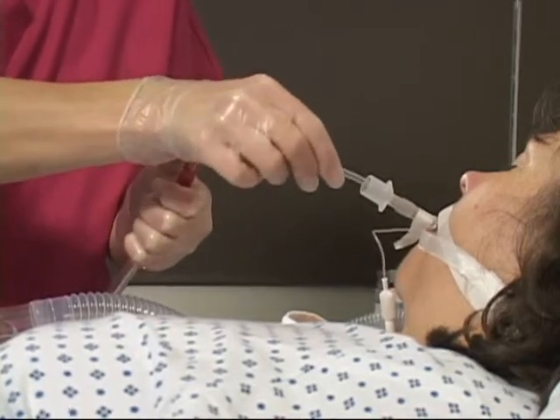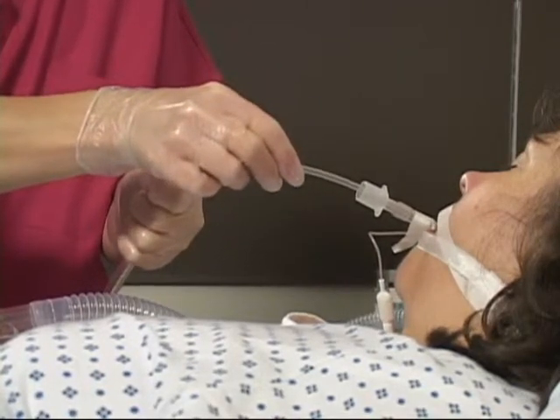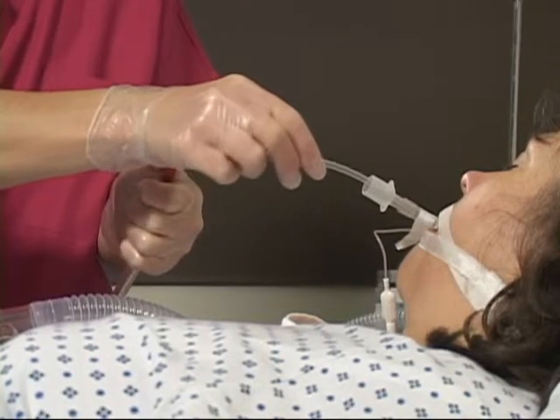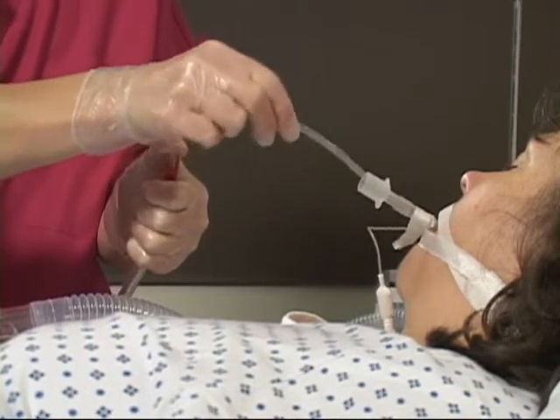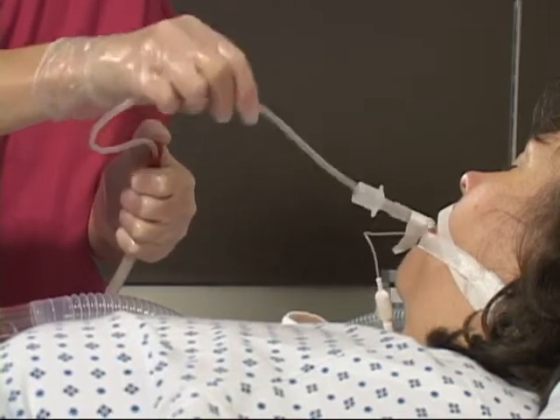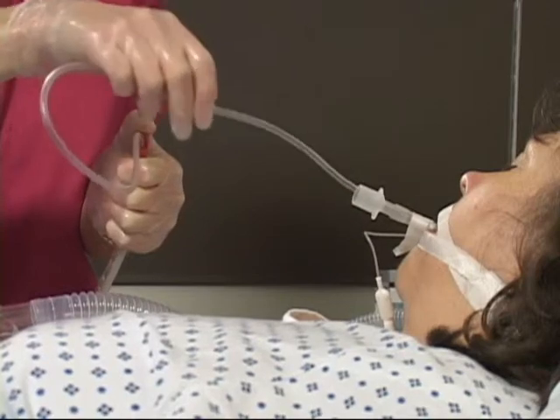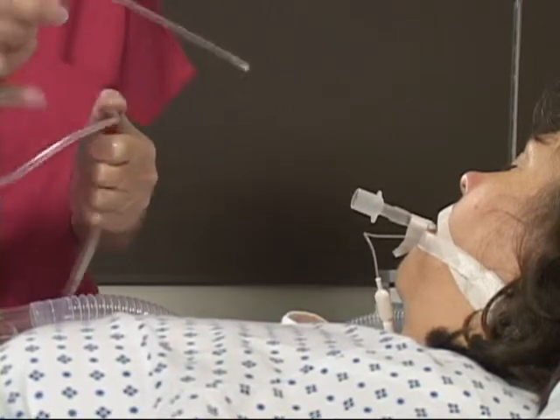Withdraw the catheter 1 to 2 centimeters to avoid suctioning tissue and apply intermittent suction while rotating and removing the catheter. This aspiration should not exceed 10 to 15 seconds, but should be slow enough to allow for mucus to be grabbed by the suction tip.